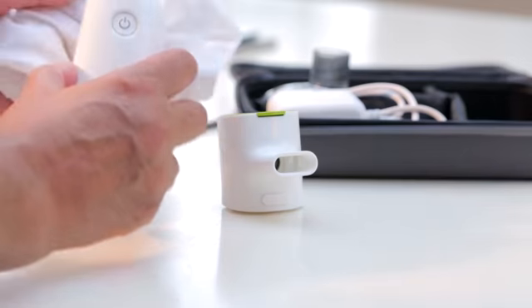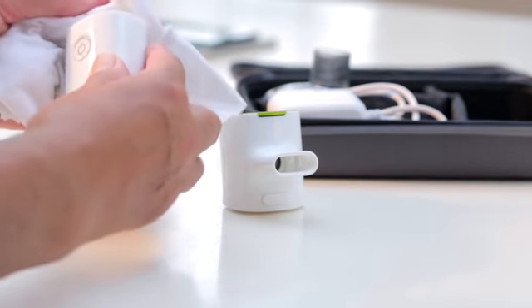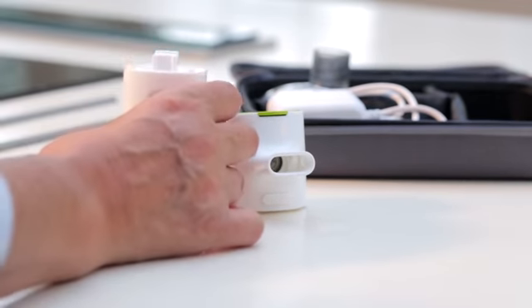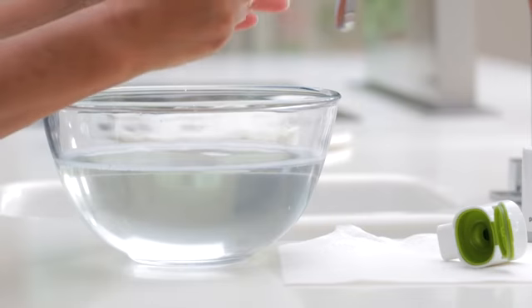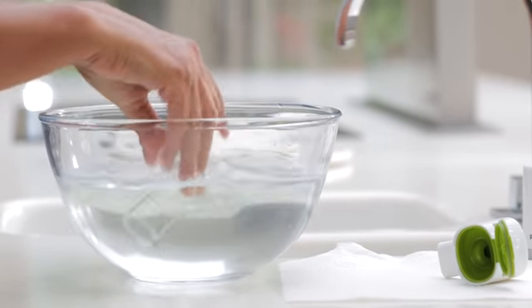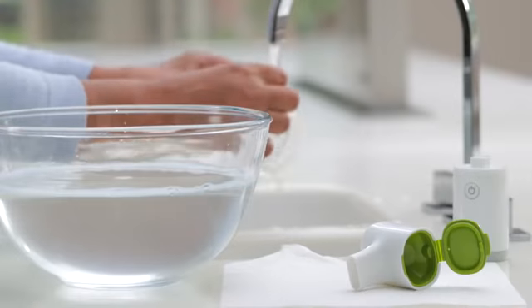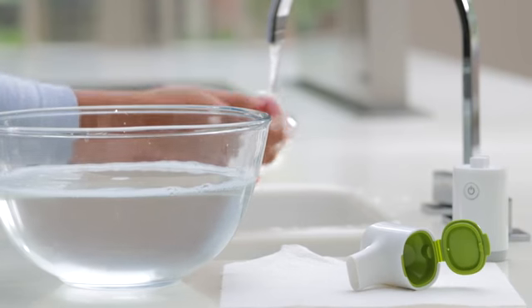General care. Cleaning the handset couldn't be easier — simply wipe with a clean damp cloth weekly, or whenever needed. If you're using a mask, then once a week you should wash it in warm soapy water for two minutes, or leave to soak for ten minutes. Rinse it under running water and leave it to air dry.